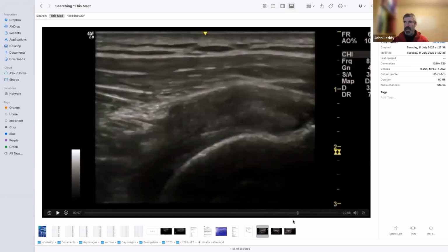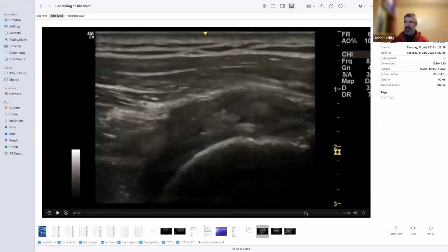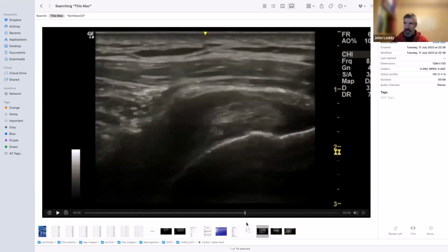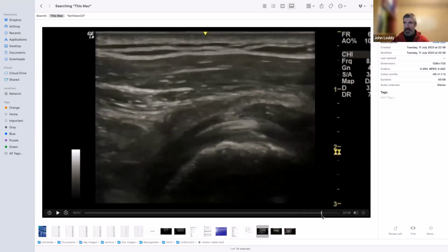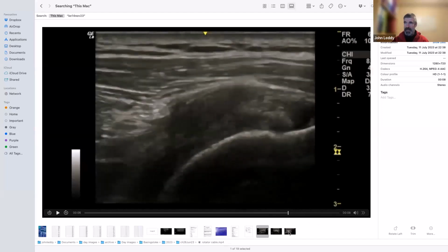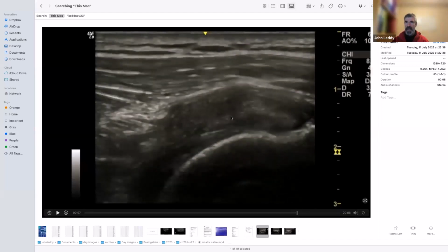It's going in the other direction. Fascinating. You don't often see it that well, and it really takes the eye of faith. But you can see that cable, particularly if I move it reasonably fast. You can see that hopefully popping out just there.